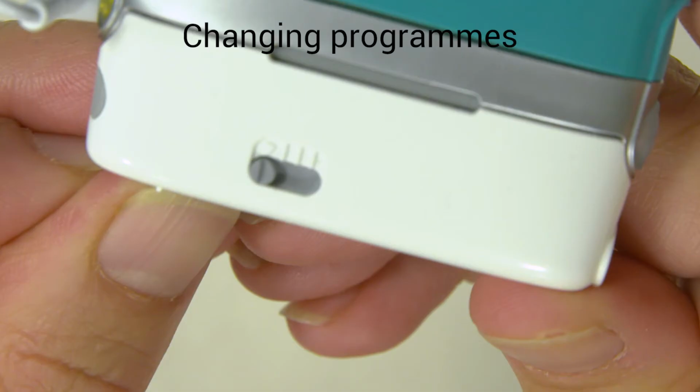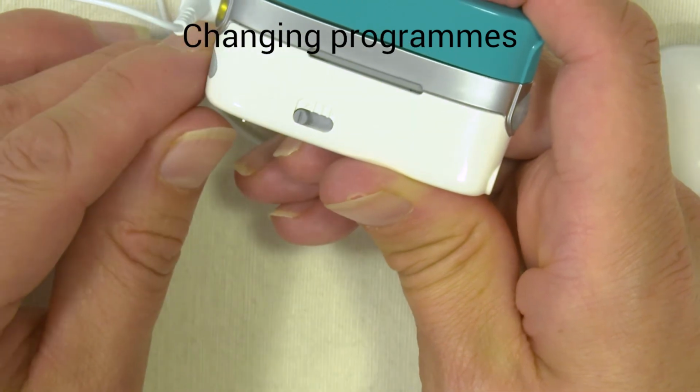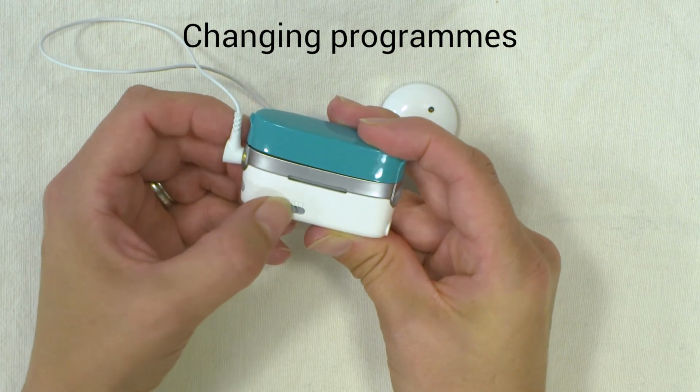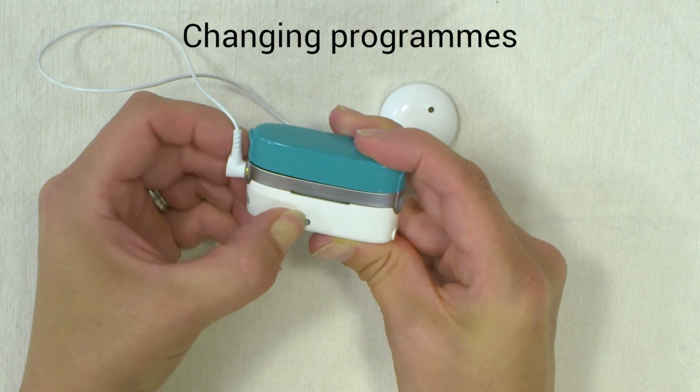The triangle at the end is for listening checks. So if you want to carry out a listening check with headphones, you need to put it on the end, which is the triangle. You do have to make sure that you're getting the little switch in the right place.